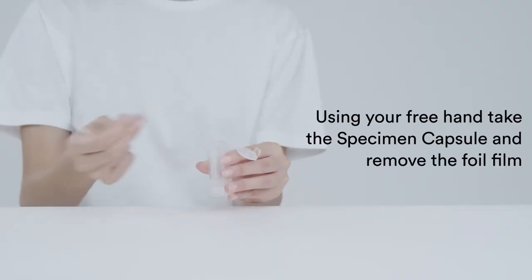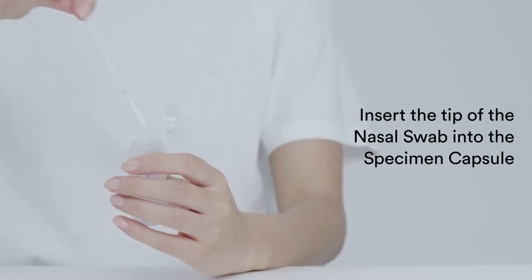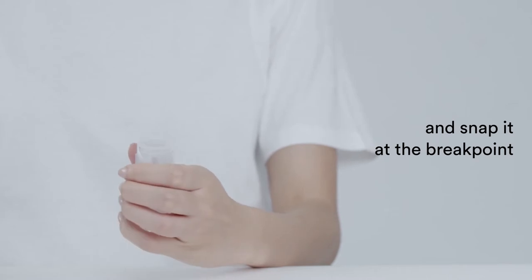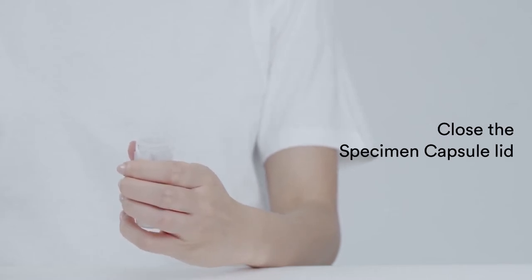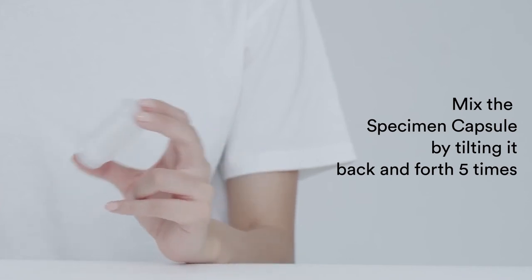Using your free hand, take the specimen capsule and remove the foil film. Insert the tip of the nasal swab into the specimen capsule and snap it at the breakpoint. Close the specimen capsule lid. Mix the specimen capsule by tilting it back and forth five times.